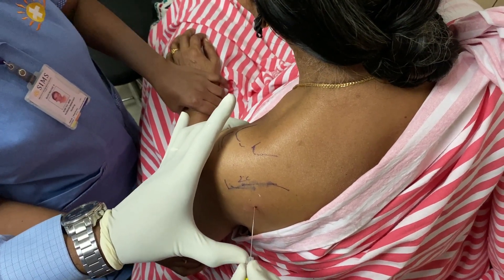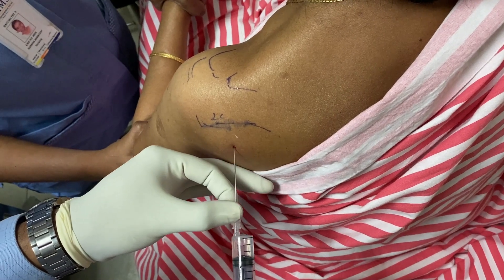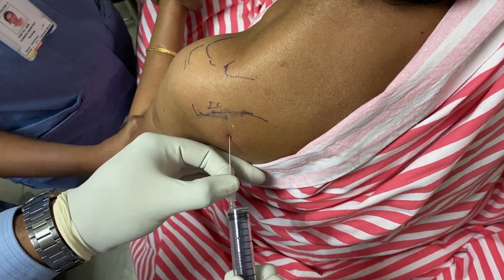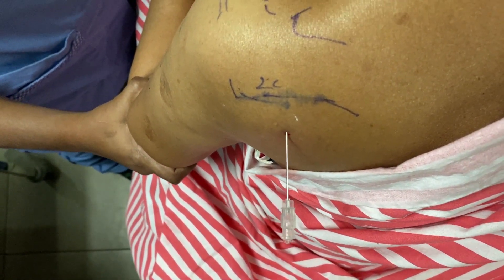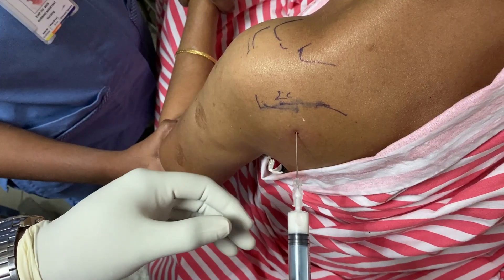As you can see, the direction of the needle is too medial and the direction is changed. One may notice a slight give-away as you enter the joint capsule. The local anesthetic ropivacaine is injected now. And if the needle is inside the joint, one may notice a nice backflow of fluid out of the needle. This backflow confirms the position of the needle inside the joint.